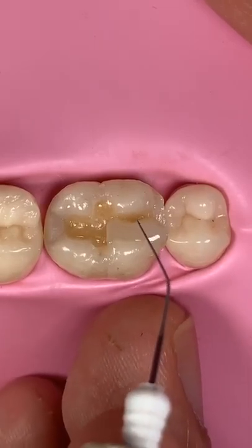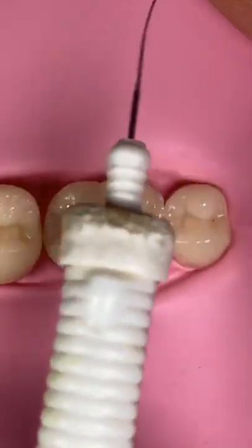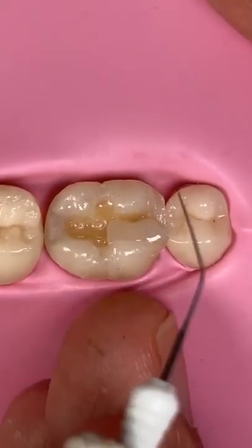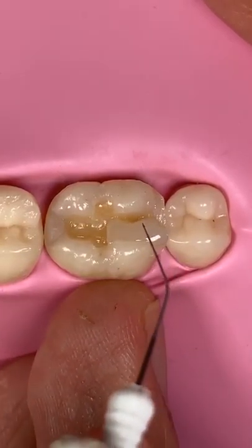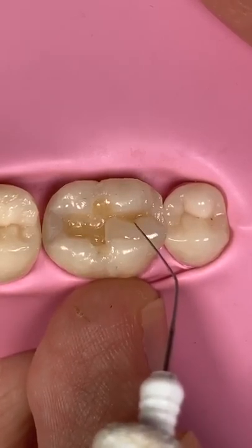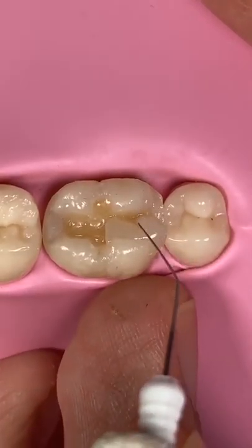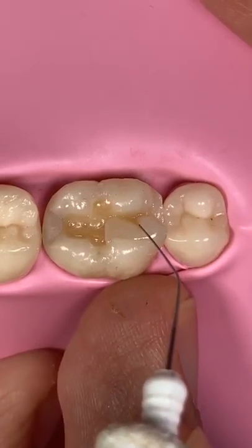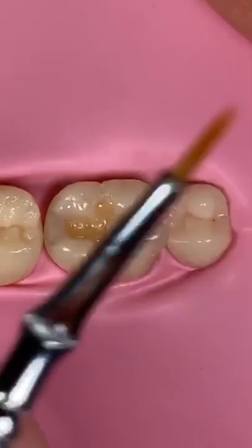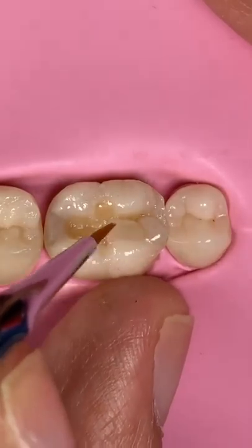Yes, but actually mine got broke. See, this is very bad, but I can make money with this instrument. Okay, so I'd like to put some secondary anatomy. I don't know, I really like secondary anatomy, you know. So basically what you do is just doing stabbing technique like this, very gently. You see, it's too big, you need to make it close, just like that.